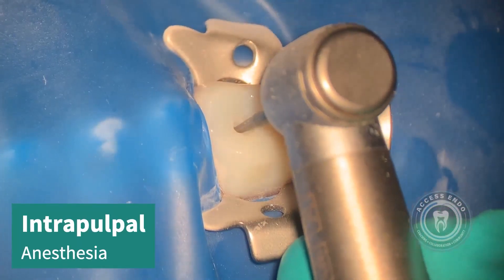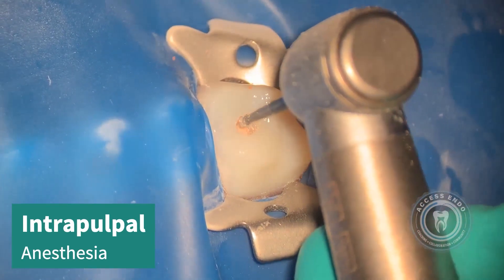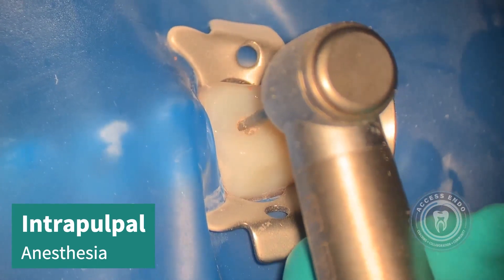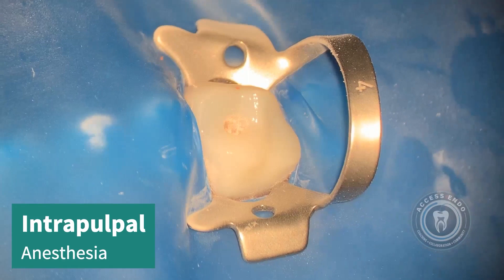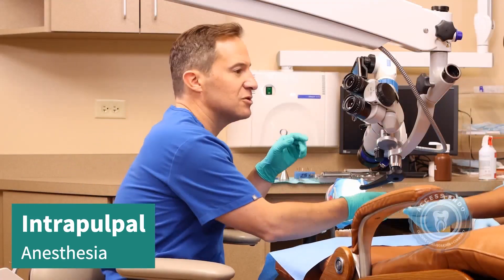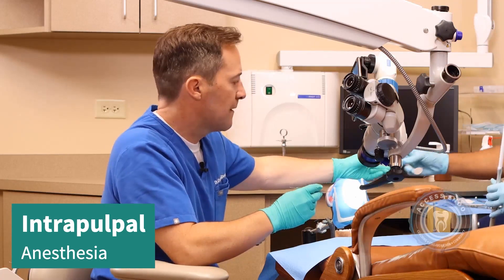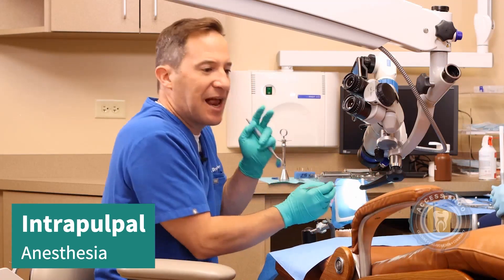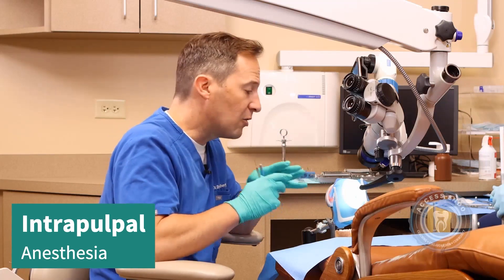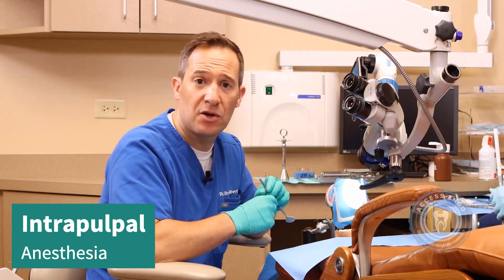We're going to go ahead and make a little more progress. Right there, I actually feel the progression where the resistance changes, and I sort of break into the pulp chamber. You can see the little waxy substance that's come up there. Now what I like to do the second I get into a pulp chamber — I'll take the mirror — I want to do a little test. I'll say, okay ma'am, do you feel that at all? And she'll say, yes, I do. Okay, that's exactly what I was mentioning earlier. There's always a chance you could feel a little something.